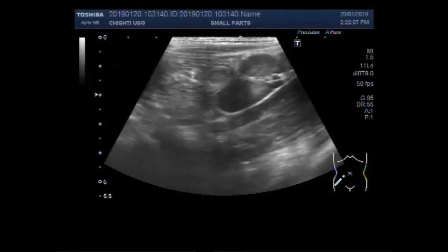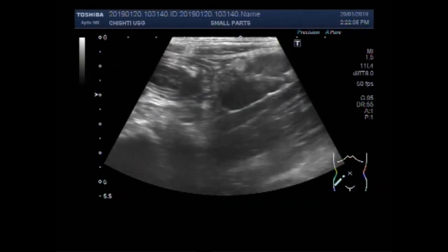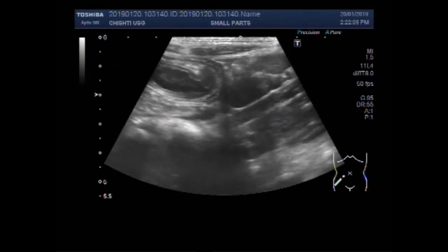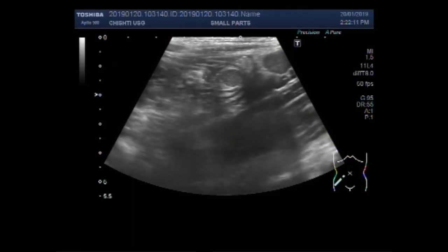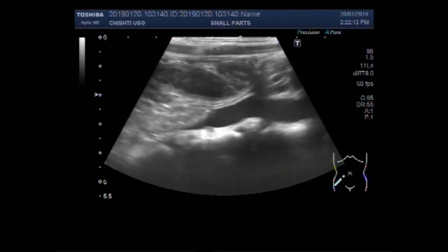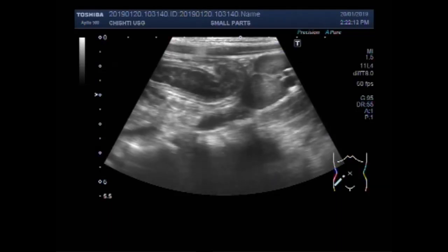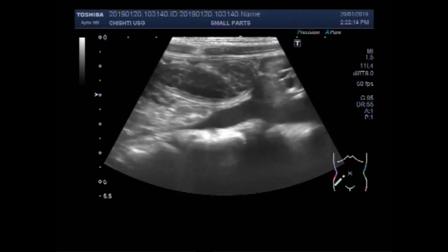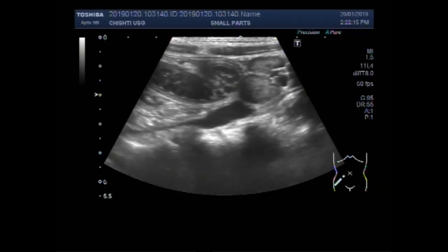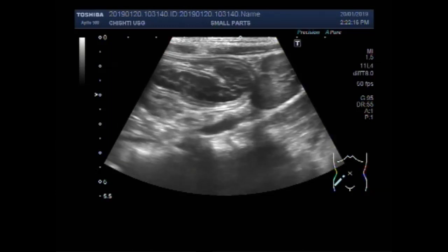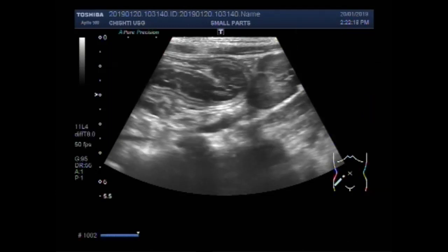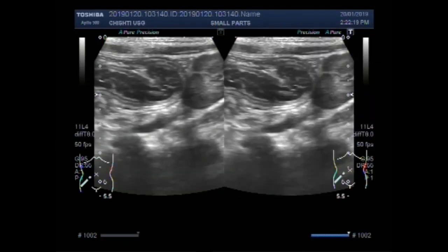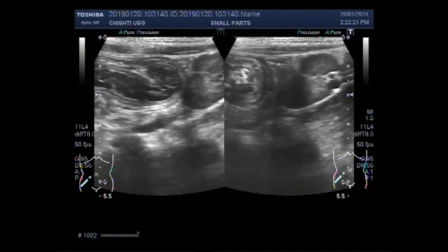Now you can see 3 enlarged lymph nodes. These are all lying just adjacent to the inflamed gut loop.